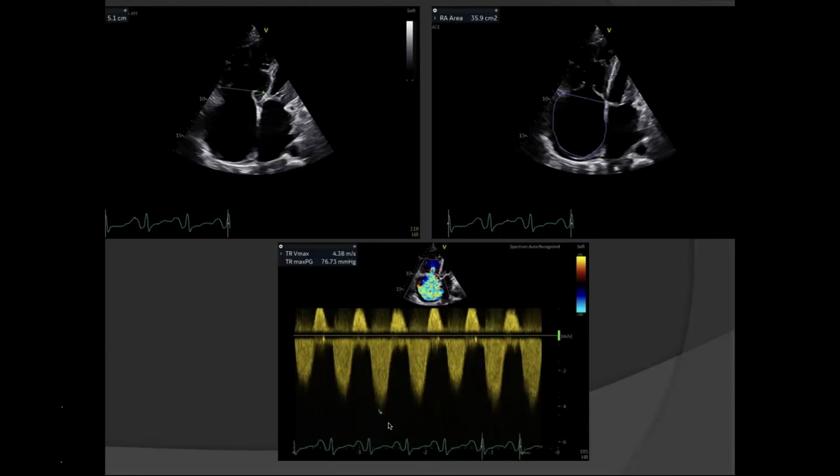Where will the right atrial pressure be maximum? Will it be with inspiration or will it be with expiration? The right heart inflow increases with inspiration or decreases with inspiration? Increases with inspiration. So the flow will be more and hence the pressure will also be more in case of inspiration. So you can take it as the inspiratory pressure that we measured. Am I right, Dr. Hansa?